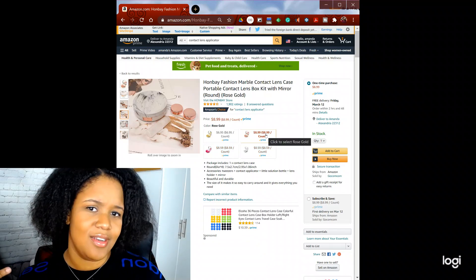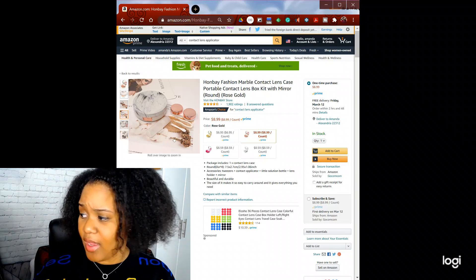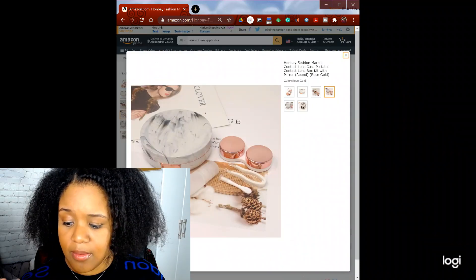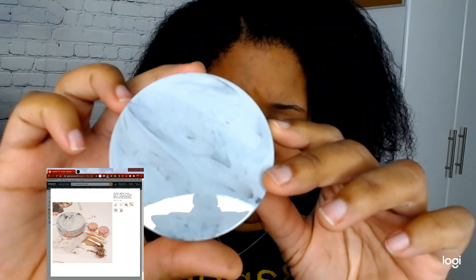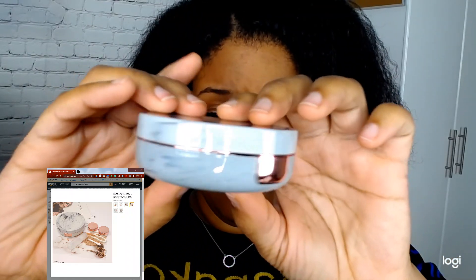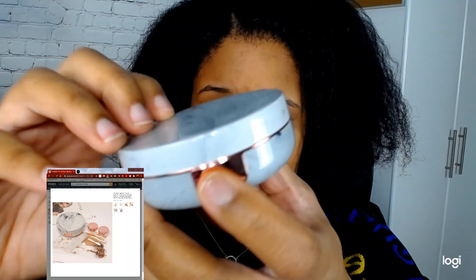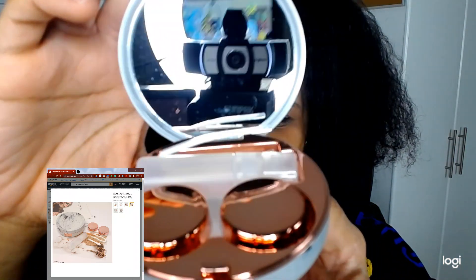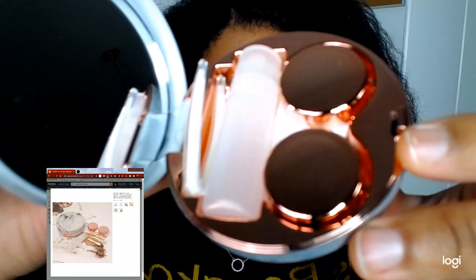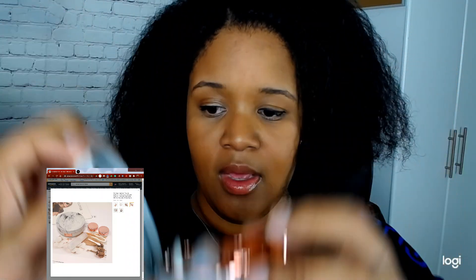I like the rose gold because I love rose gold in my life. So compared to the listing, I'm going to show you the actual product. It looks exactly how it came. It has a little mirror inside. Everything on the inside is exactly as the pictures portray.